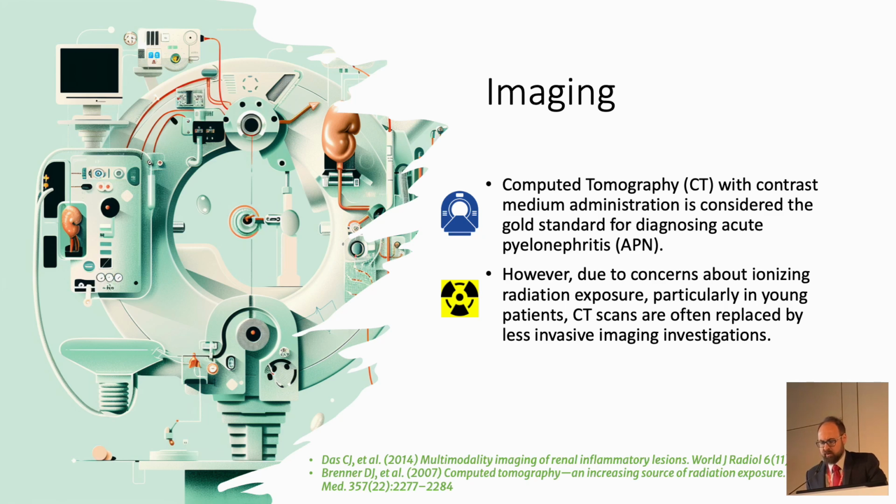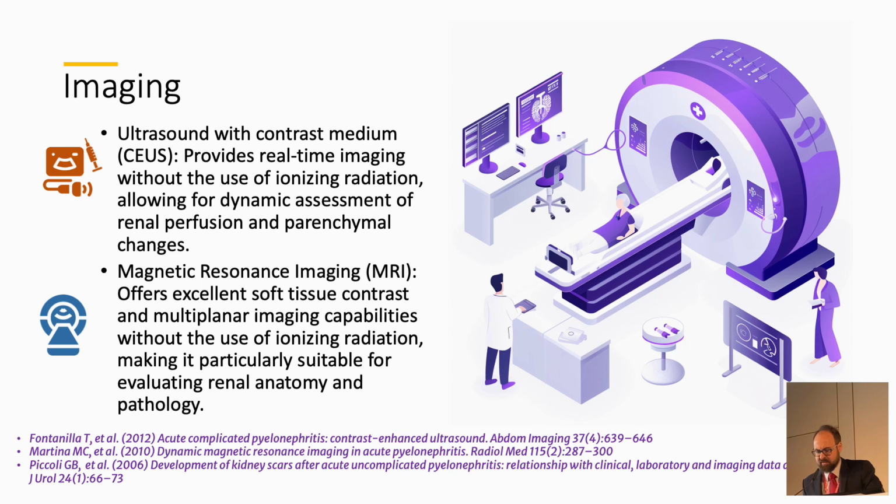Computed tomography with contrast medium administration is considered the gold standard for diagnosing acute pyelonephritis. However, due to concerns about ionizing radiation exposure, particularly in young patients, CT scans are often replaced by less invasive imaging investigation. Ultrasound with contrast medium provides real-time imaging without the use of ionizing radiation, allowing for dynamic assessment of renal perfusion and parenchymal changes.